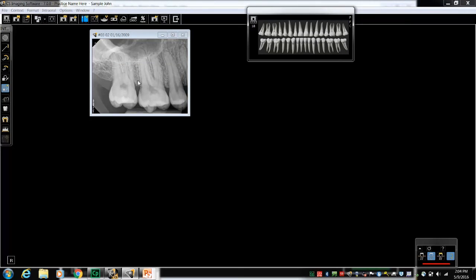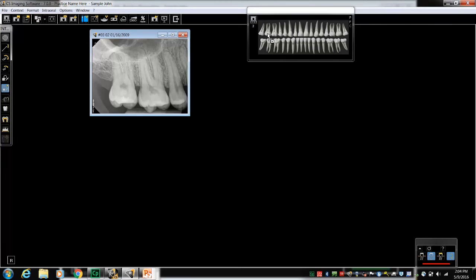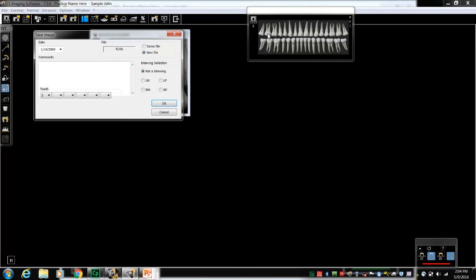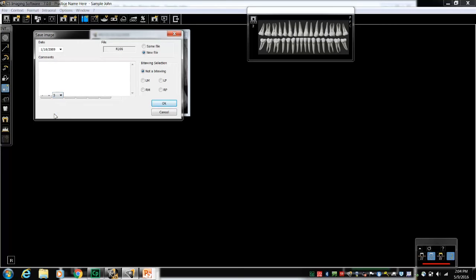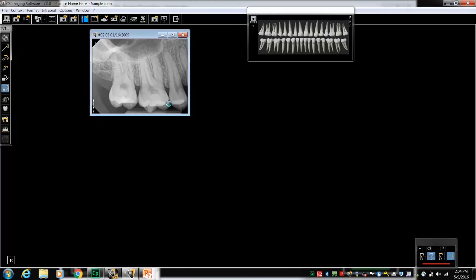Another option for saving involves dragging the single image to the selected tooth in the dental arch filter. For instance, if this was an image of tooth number 2 and 3, I would left click and hold and drag and drop the image over one of those teeth. It'll pre-populate the window with the number 2. I can add additional teeth numbers such as tooth number 3 so that now it's saved to tooth number 2 and 3.